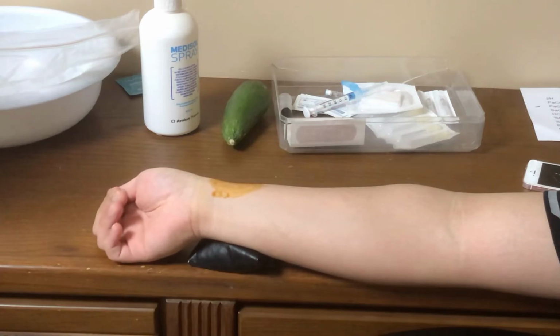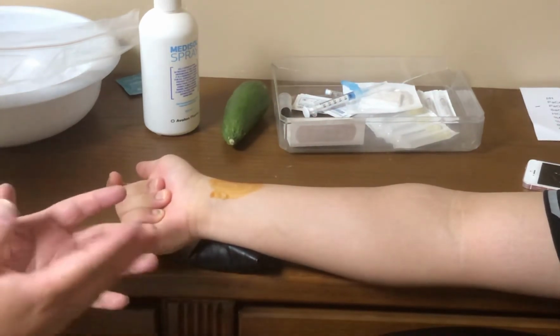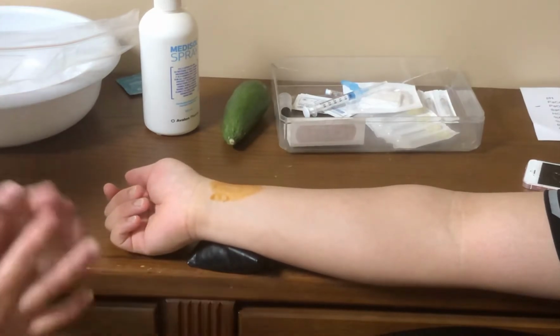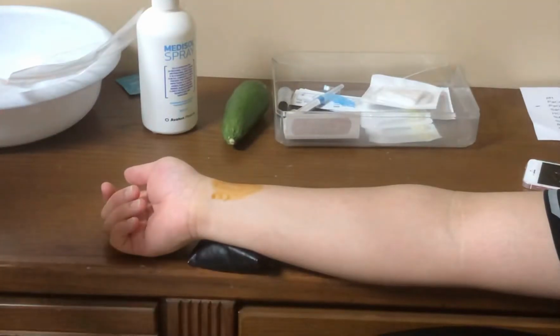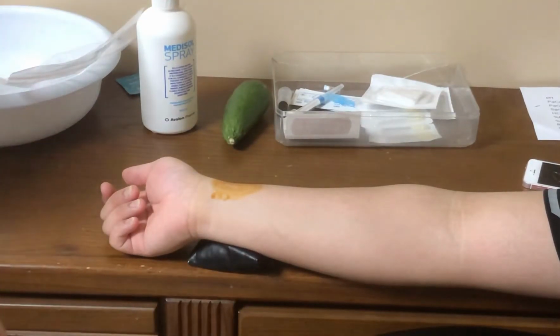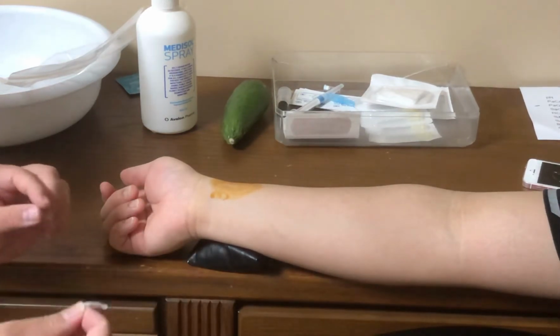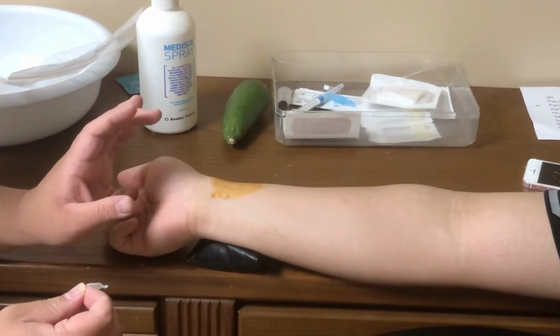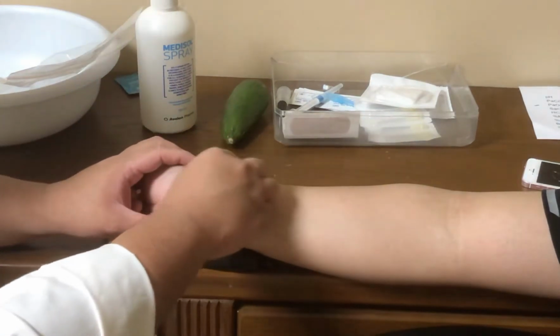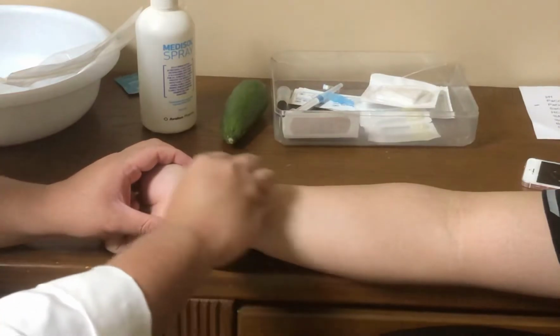After this, we need to let it dry in order to reduce the risk of any local infection or systemic sepsis. Once it has dried out, get your alcohol swab and cleanse the site, and also allow it to dry in order to avoid any pain to the patient while puncturing. Removing the color of the povidone iodine from the site will help the site be more visible and increase the chances of puncturing the radial artery.